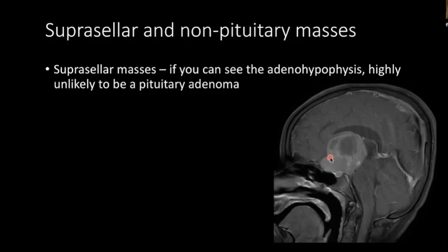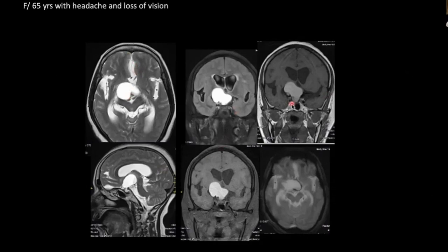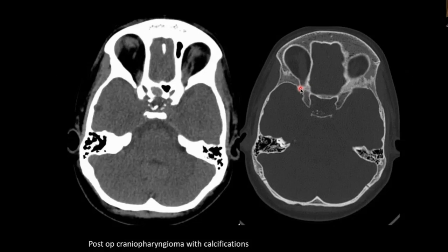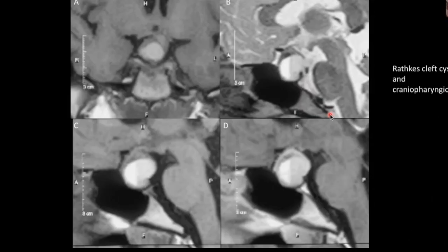Macroadenomas are common, but if the adenohypophysis is visible separately from the suprasellar tumor, this is not a macroadenoma — it is something else. Always look for differential enhancement of the adenohypophysis on post-contrast images or differential signal on T2. Here we see a suprasellar cystic lesion that is T1 hyperintense with blooming on gradient sequence — a 65-year-old lady with headache and loss of vision. This is a craniopharyngioma. Craniopharyngiomas can also show multiple tiny cysts, heterogeneous enhancement, and calcification.